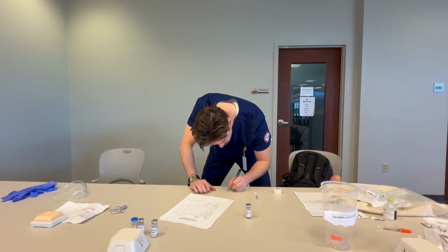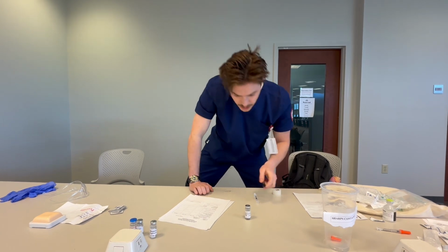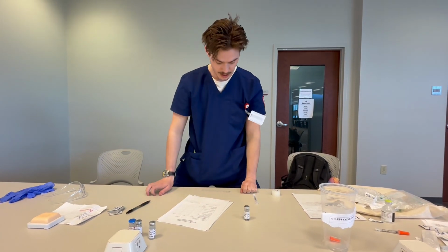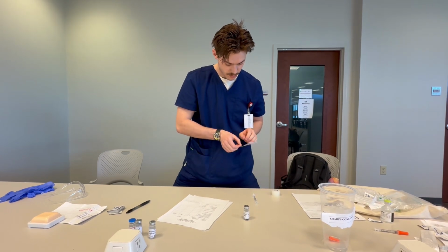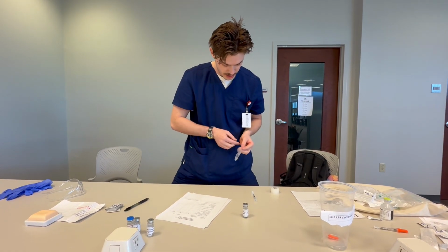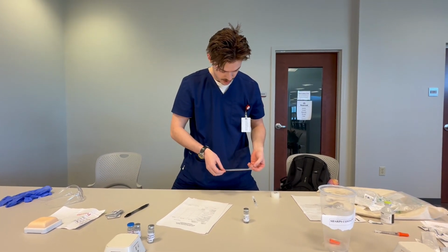And the right amount, which is 10 units. So I will then label my syringe.